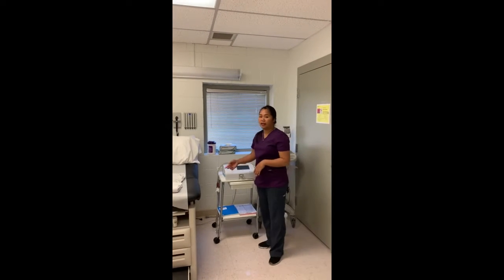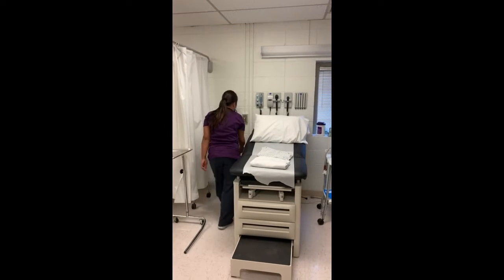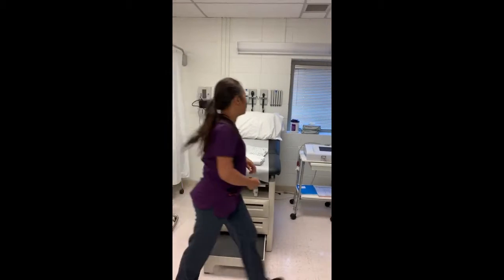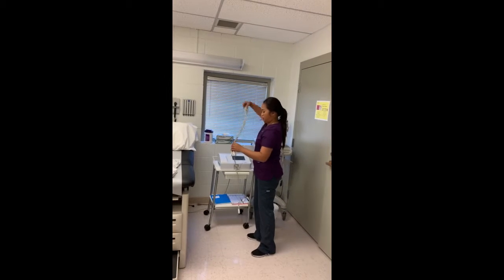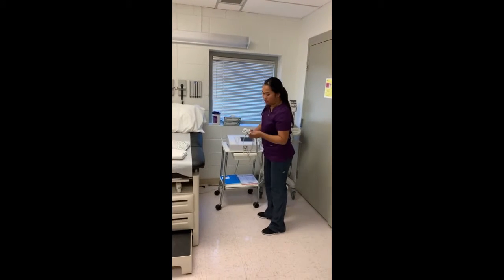Okay, now I'm going to go ahead and check the machine plug if it's intact. Yes. So I'm going to check the lead wires as well. Everything looks good.